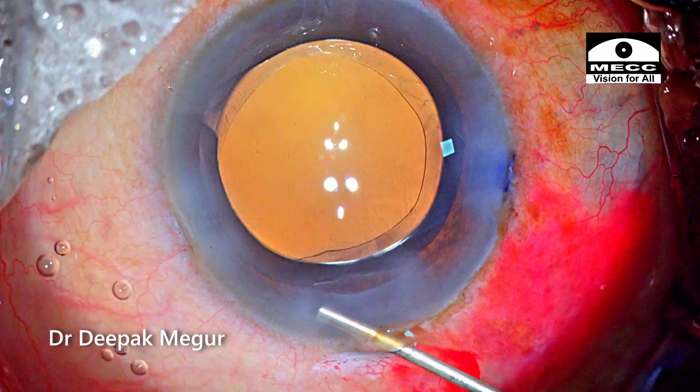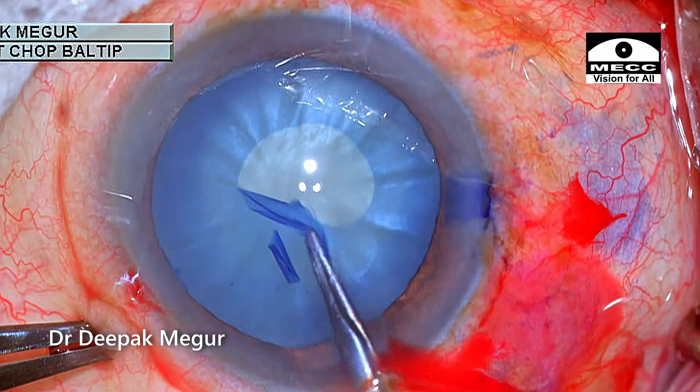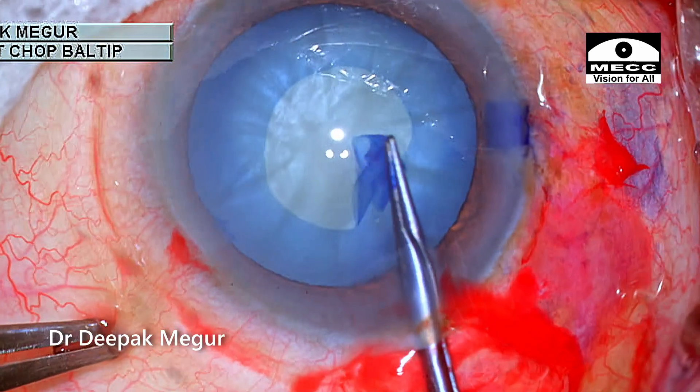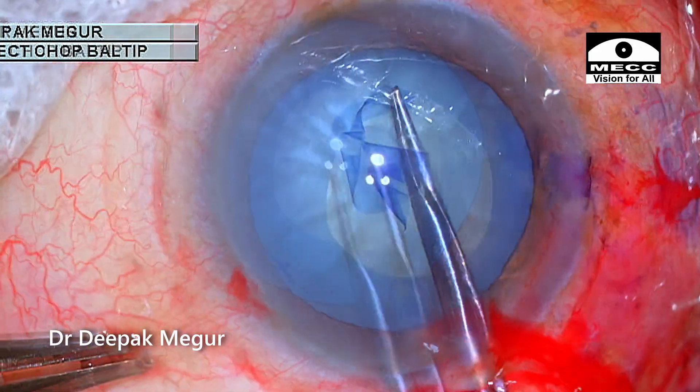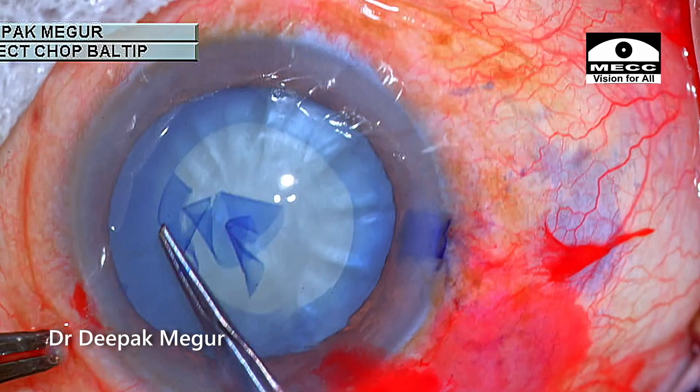The side ports are hydrated and the case ends quite well. To summarize — what did I learn from this case? Never take anything for granted. I became a little complacent. Changing the plan from a two-stage rhexis to the swirling or spiraling technique was not the wisest decision.